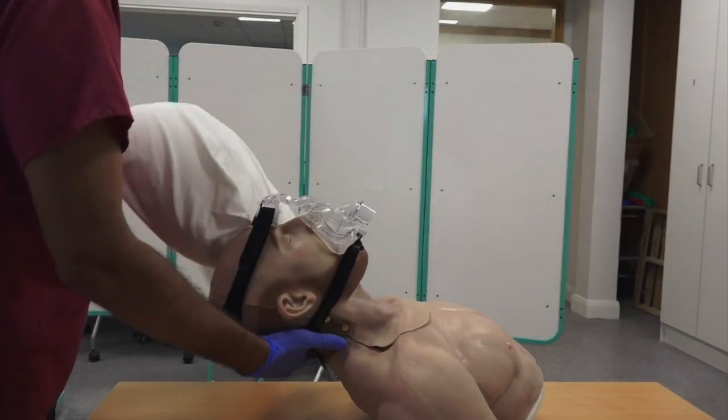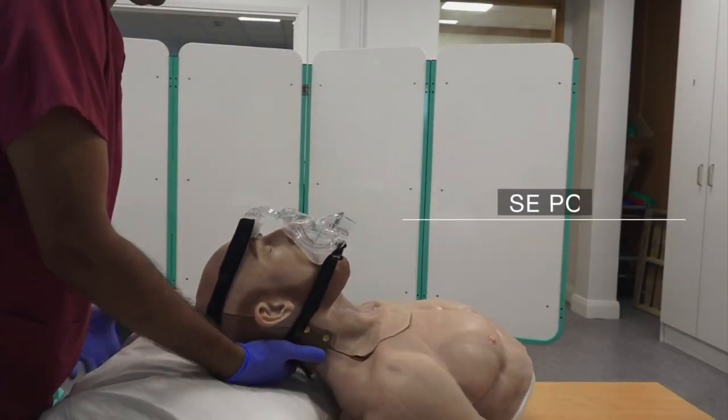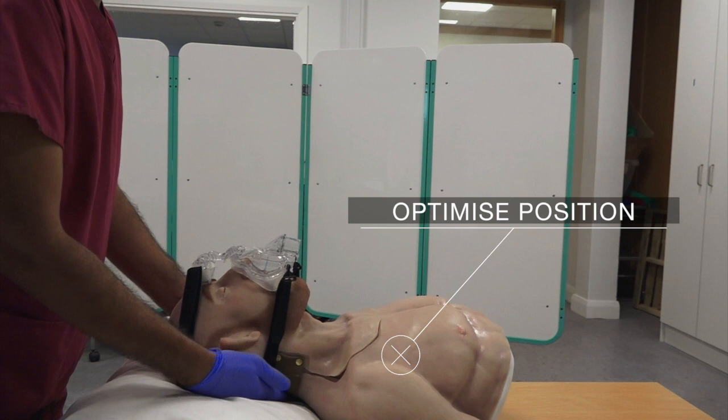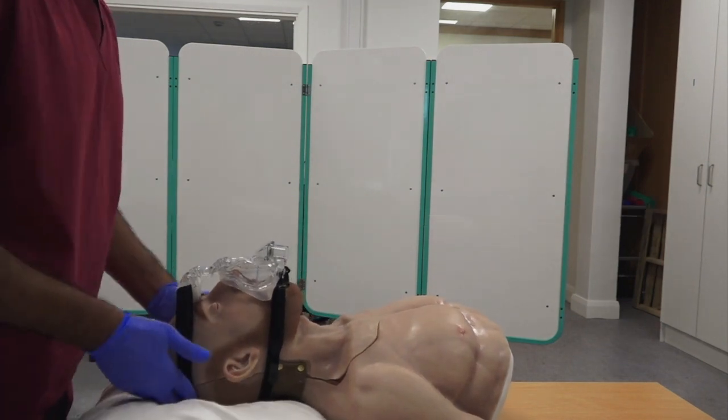Optimize the patient's position by placing him or her in the sniffing position. This involves flexion of the neck and lifting of the chin. The mastoid process of the skull should be aligned with the sternum. Optimizing position may involve adding or removing pillows.